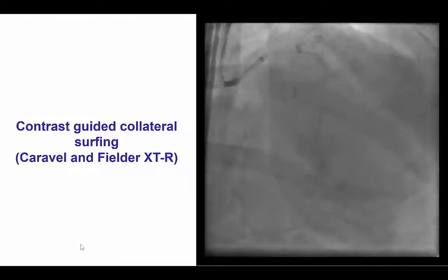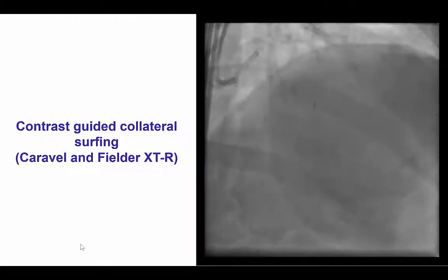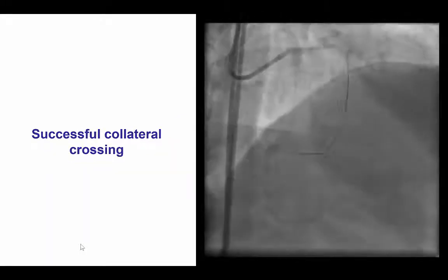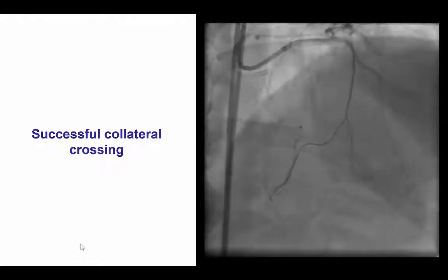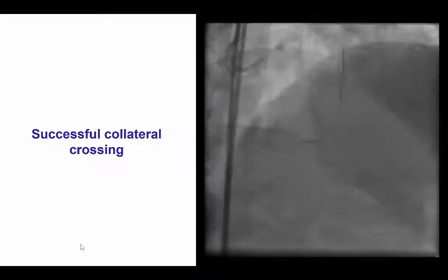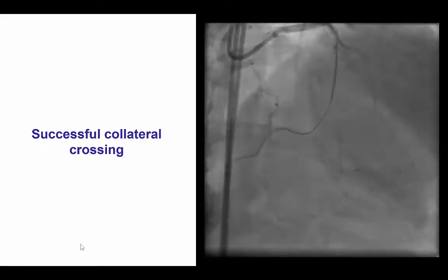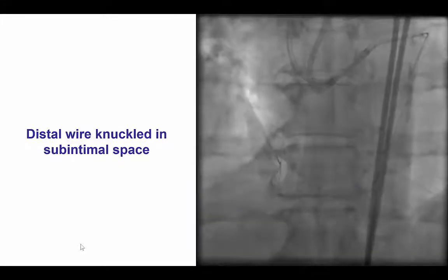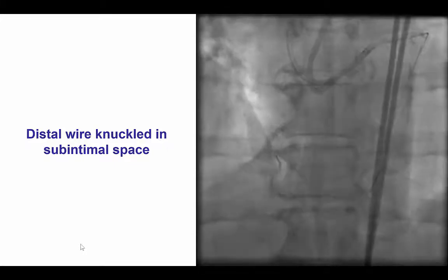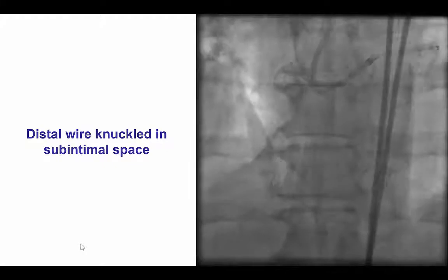A CARAVAL microcatheter was advanced to a septal branch, followed by both surfing as well as contrast injection, and finally we were able, using a FIELDER XTR guide wire, to cross from the LAD into the right coronary in the right posterolateral branch. We then advanced the CARAVAL all the way to the distal right coronary artery, and then started knuckling with a FIELDER XTR guide wire and a PILOT 200 into the mid-right coronary artery.